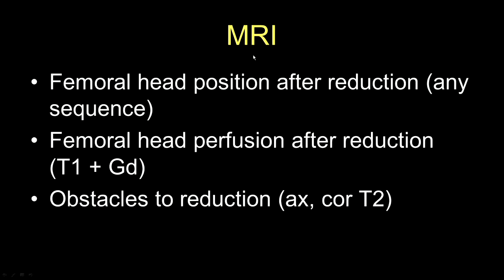For the most part, we've been talking about ultrasound, which is the mainstay of the evaluation of hip dysplasia. So when do we use MRI? The first indication is to look at the position of the femoral head after reduction in cases of severe hip dislocation — you can use any sequence, typically T2-weighted or proton-density-weighted images. You can also evaluate femoral head perfusion after reduction and placement in a spica cast, for which you need gadolinium. And MRI can be used to evaluate obstacles to reduction, which you can see on axial and coronal T2-weighted images.